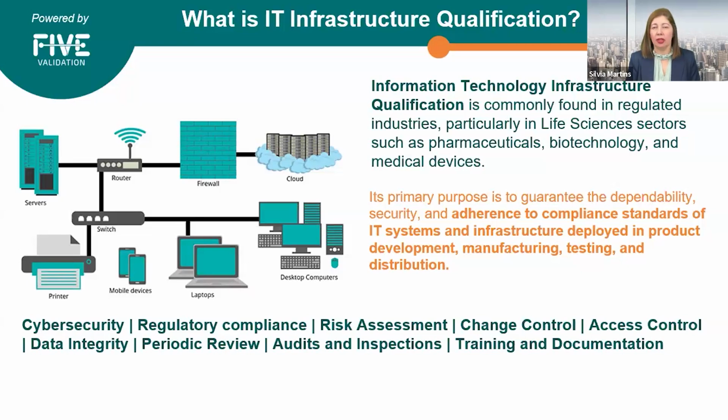Regulatory compliance. IT infrastructure qualification is essential to comply with regulatory guidelines, such as those set forth by the FDA, Food and Drug Administration in the United States, or the EMA, European Medicines Agency in Europe. These regulations require companies to ensure that their IT systems do not compromise the safety, efficacy, or quality of products. Risk assessment. The qualification process involves assessing and mitigating risks associated with the IT infrastructure. This includes identifying potential vulnerabilities, data security risks, and system failures that could impact product quality or patient safety.